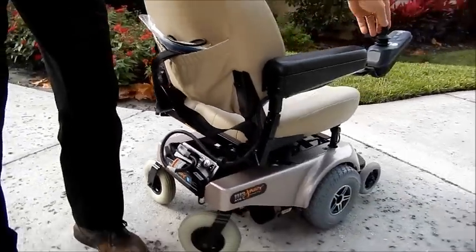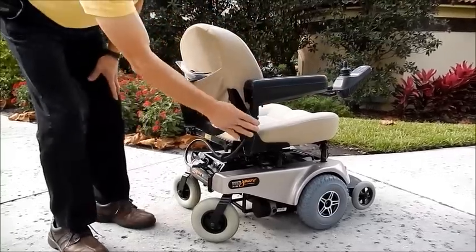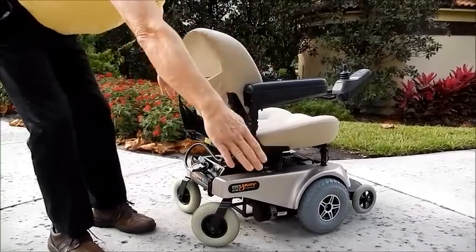This chair is also adjustable. The arms flip up. They're adjustable up and down, and they're also adjustable on the way out.